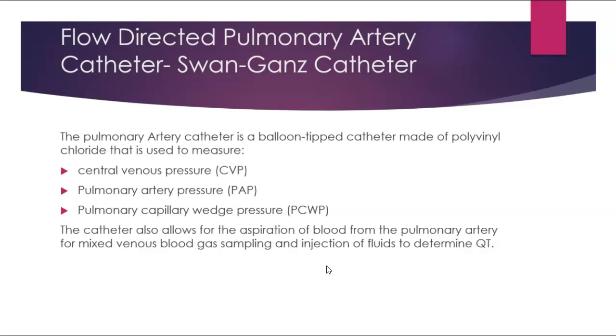And that sounds confusing. It's like, if I'm measuring my pulmonary capillary wedge pressure, the tip of that must be in my pulmonary capillary bed, but it isn't. It is actually sitting further in those pulmonary arteries and, when that balloon is inflated, measuring pressures in the capillary beds, giving us an assessment of the function of the left side of the heart.